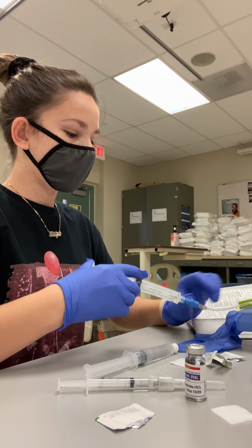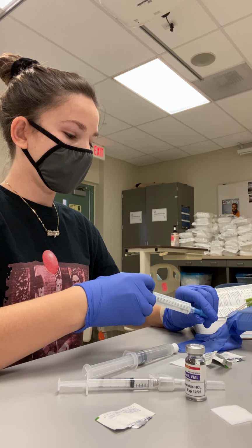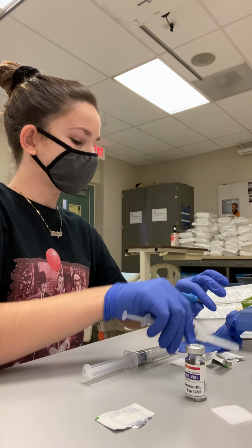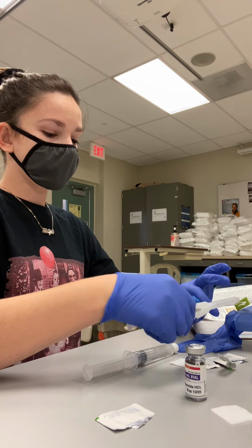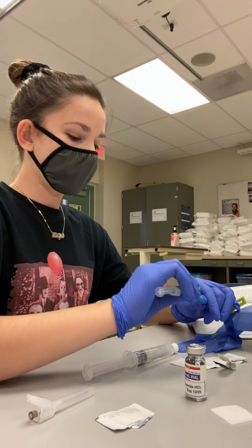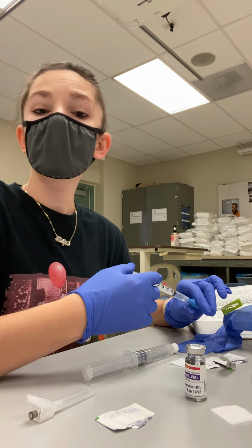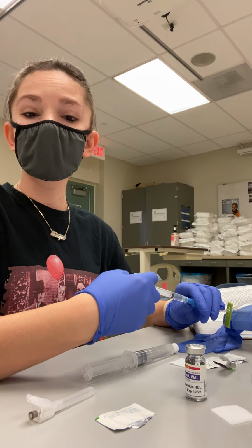Push. And you will unclamp, make sure the IV is primed. And I will apply a port. Okay. And then from here, I would then scan the patient and your medication. Got the medication. And it says to give over 2 minutes. So I will give 1/2 a milliliter each minute. So I'll give 1/2 a milliliter over 1 minute.